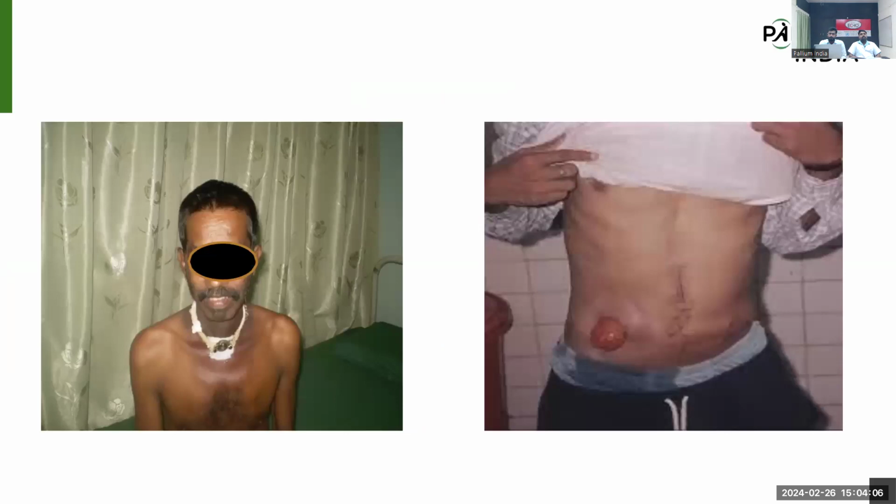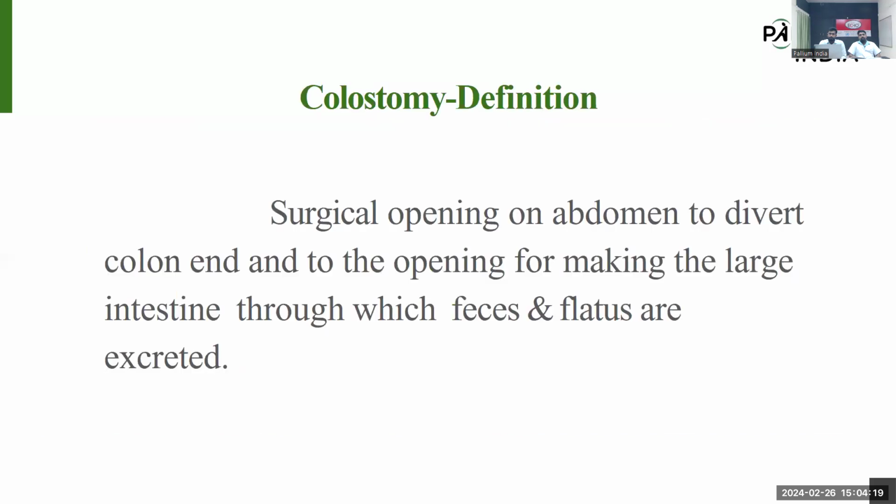So in these pictures you can see, the first one is an example of the input ostomy, tracheostomy. The second one is an example of the output ostomy, colostomy. So first of all, we're going to discuss the colostomy.